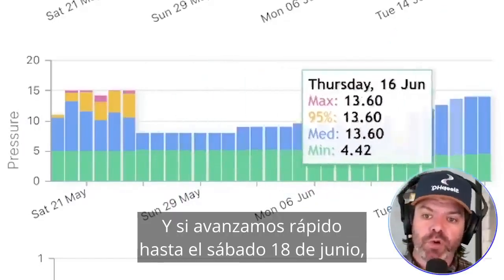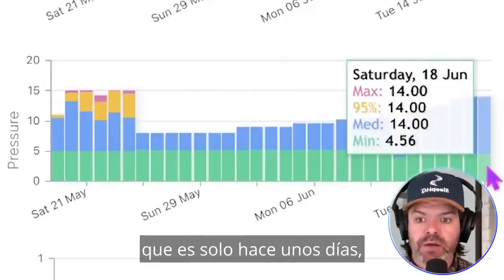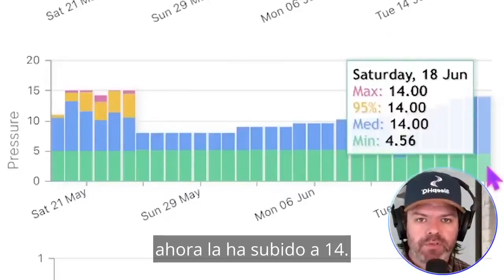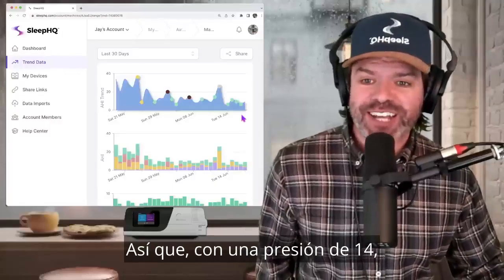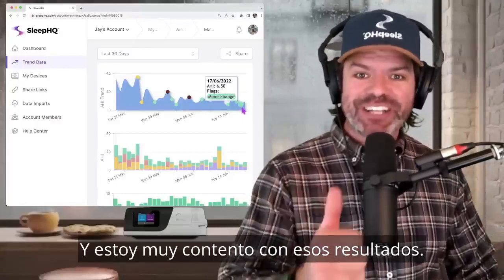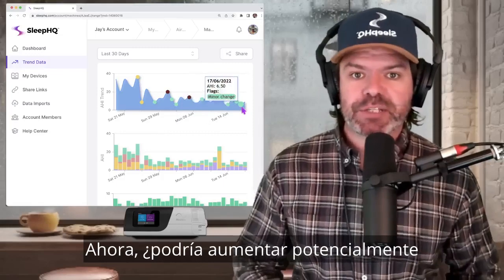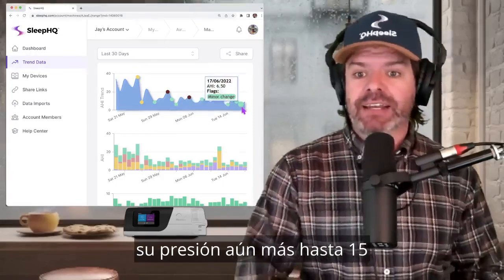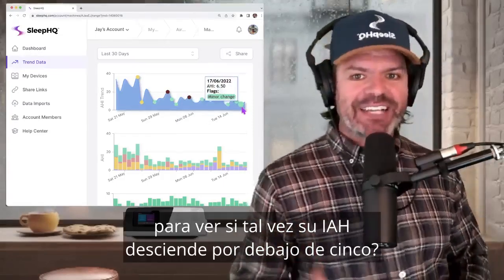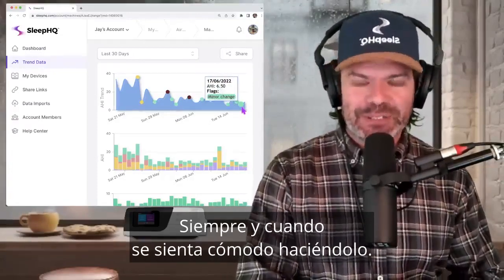And if we fast forward to Saturday, 18th of June, which is only a few days ago, he's now bumped it up to 14. So on a pressure of 14, Jay has an AHI of 6.5, and I'm pretty stoked with those results. Well done, buddy. Now, could he potentially increase his pressure even more, up to 15, to see if perhaps he can get his AHI under 5? Of course he can, as long as he's comfortable in doing so.